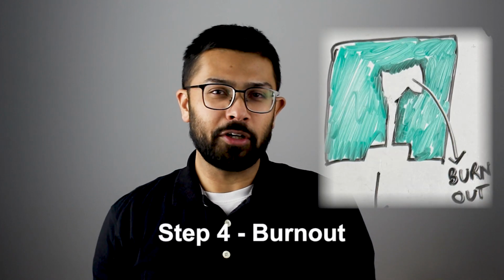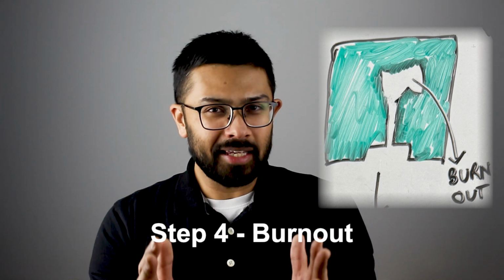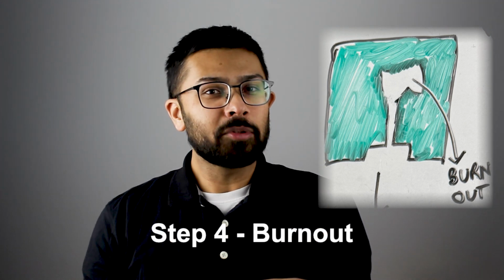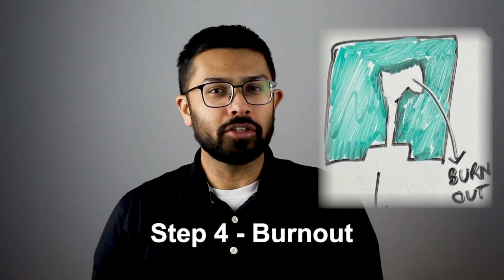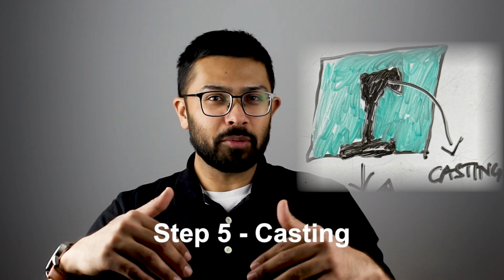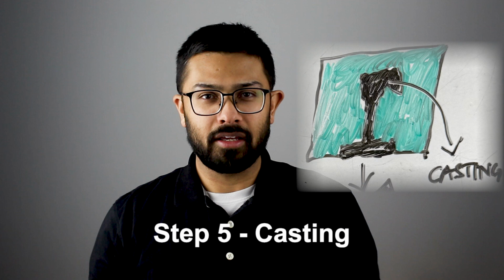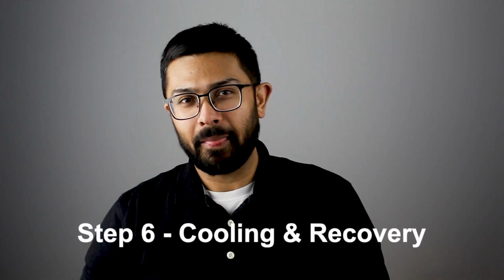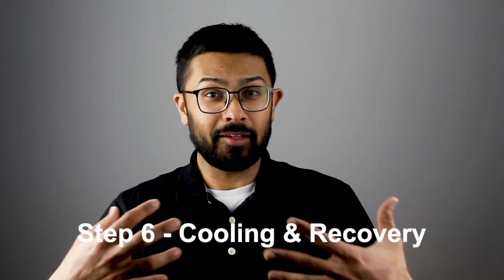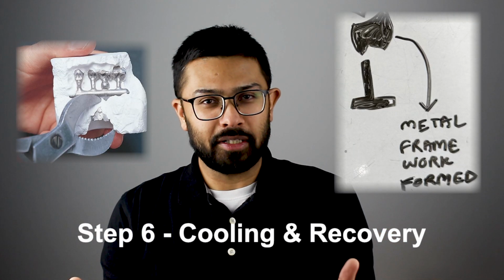Then there's the burnout phase. The mold is heated to eliminate the wax, leaving a cavity in its exact shape. The temperature must be carefully controlled to ensure complete wax removal. The next stage is casting. Molten metal is forced into the mold cavity using either centrifugal casting or vacuum pressure casting. And then the next stage is cooling and recovery. The metal solidifies and the investment material is broken away to reveal the final restoration.